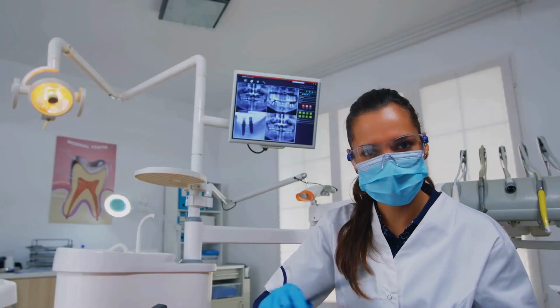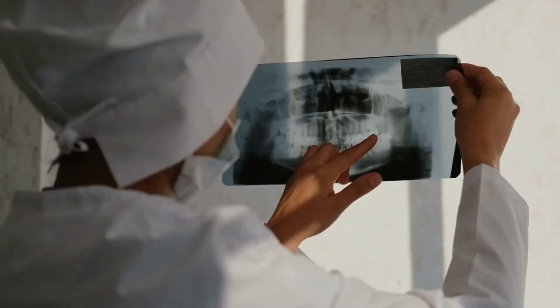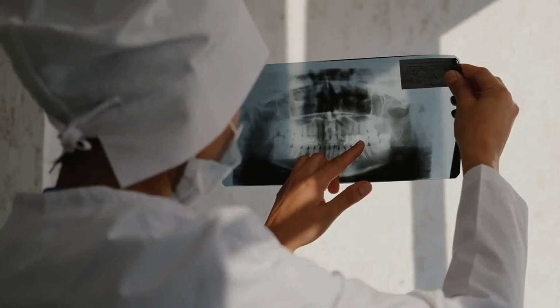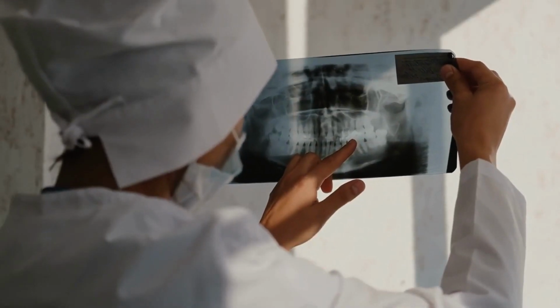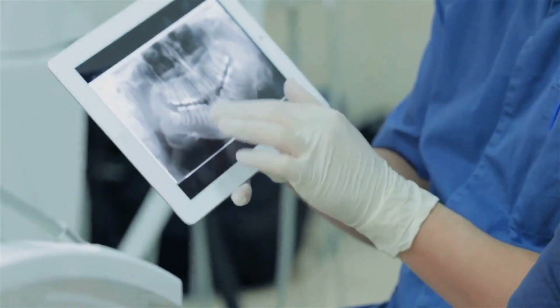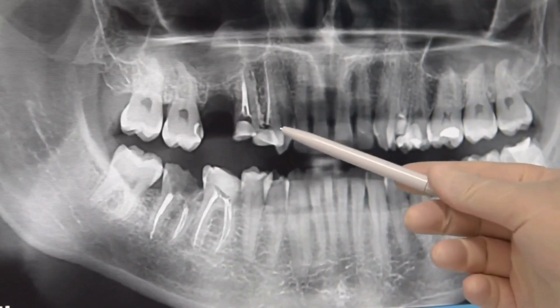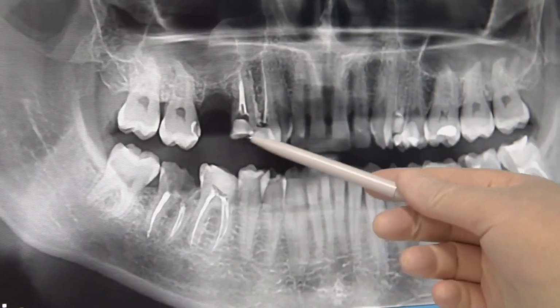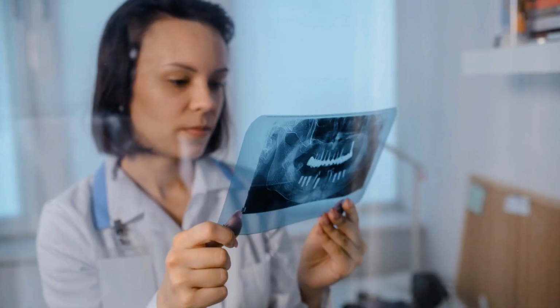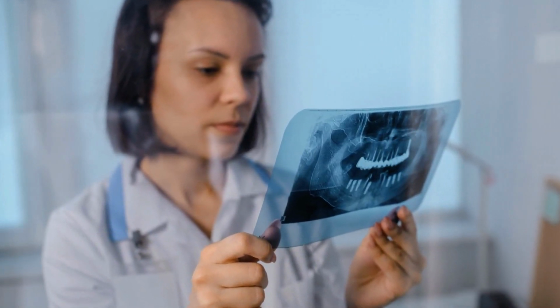Finally, cross-polarized photography enhances the visualization of certain dental conditions. For instance, in the case of dental caries, cross-polarized light can penetrate the enamel surface, revealing the extent of demineralization and the presence of subsurface lesions that might not be visible under normal light. Similarly, in the case of cracked teeth, the technique can highlight the cracks with remarkable clarity, aiding in the diagnosis and treatment planning.